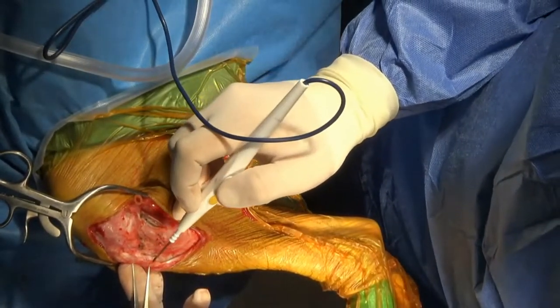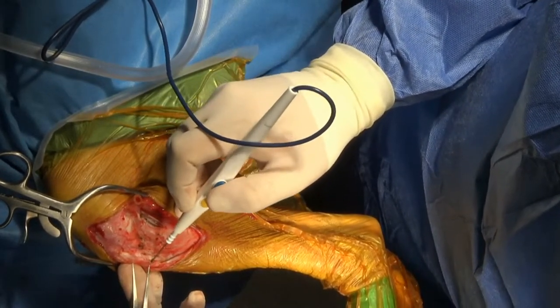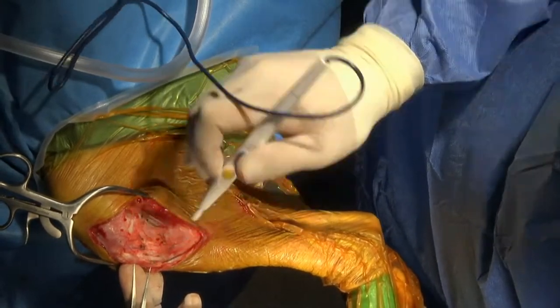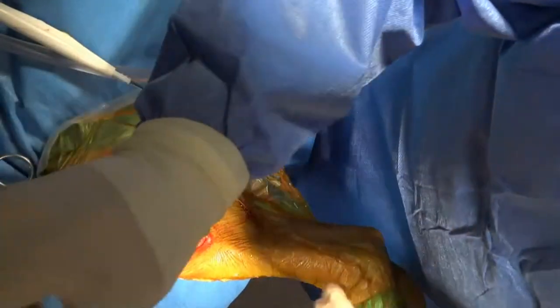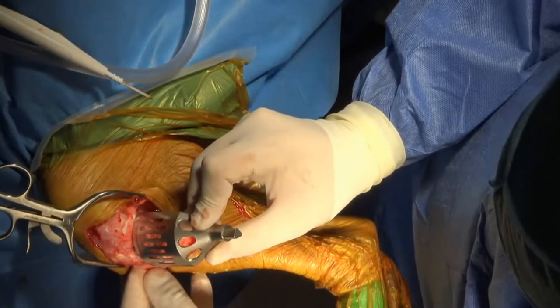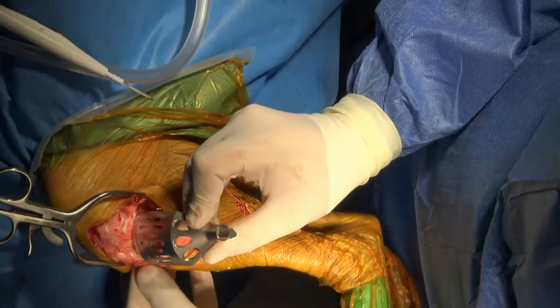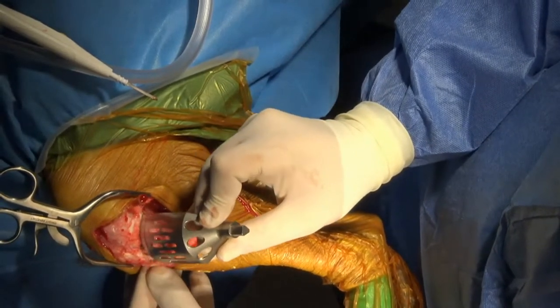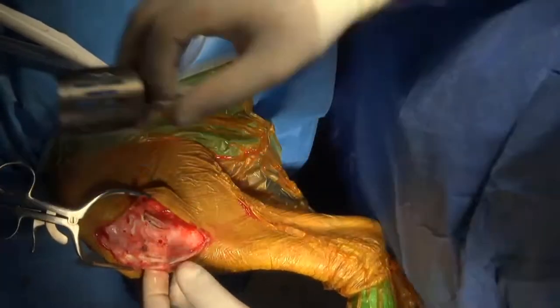Just marking here now from the tibial tuberosity down to a point on the cranial aspect of the tibia where the saw blade is actually going to exit the bone. So I've got two marks, one here caudally and another one here cranially. And with a bit of luck, the 24 saw blade is going to sit between those. This is going to work pretty nicely. So far, so good, Ewan. We want the cranial aspect of the saw blade to be coming out parallel with the cranial aspect of the tibial tuberosity, and the caudal aspect of the saw blade up here to be coming out perpendicular with the bone, which is doing that quite nicely.